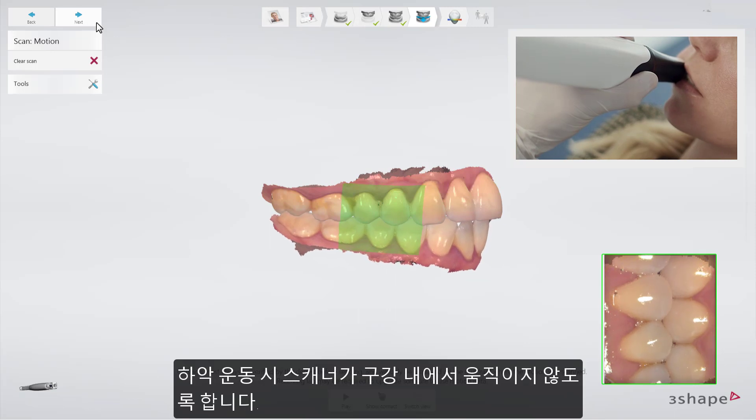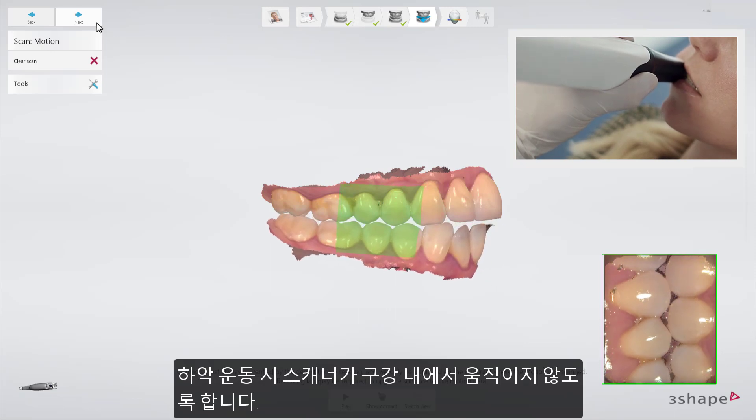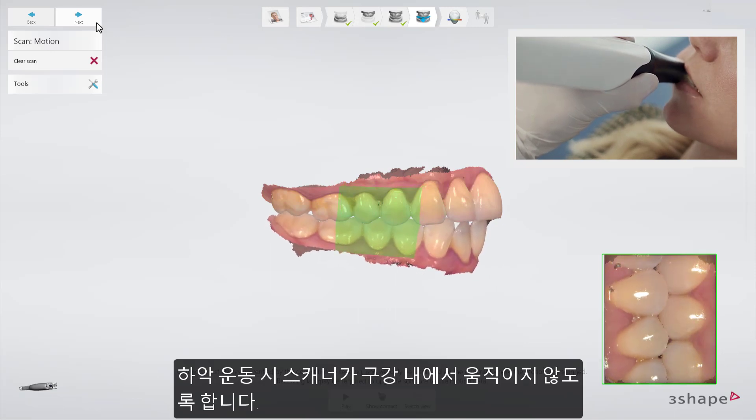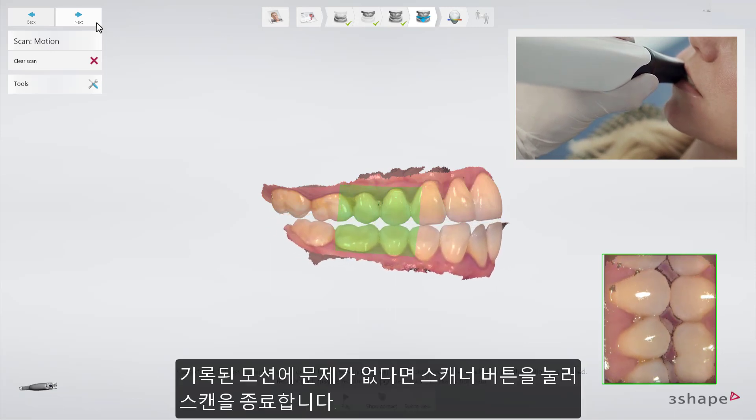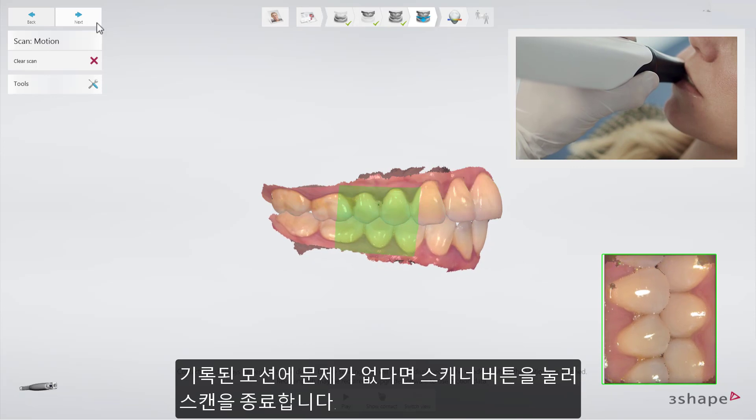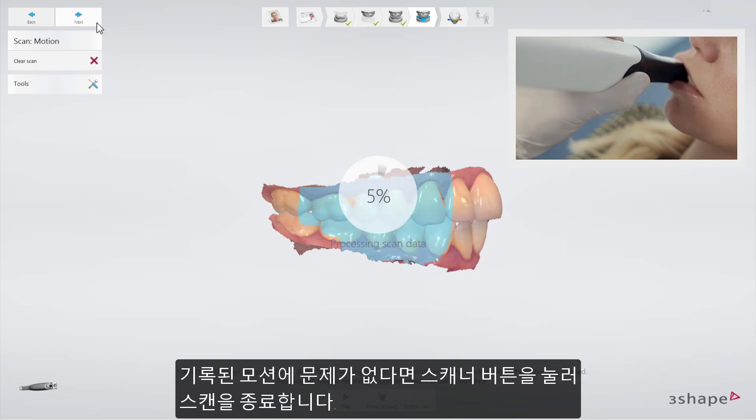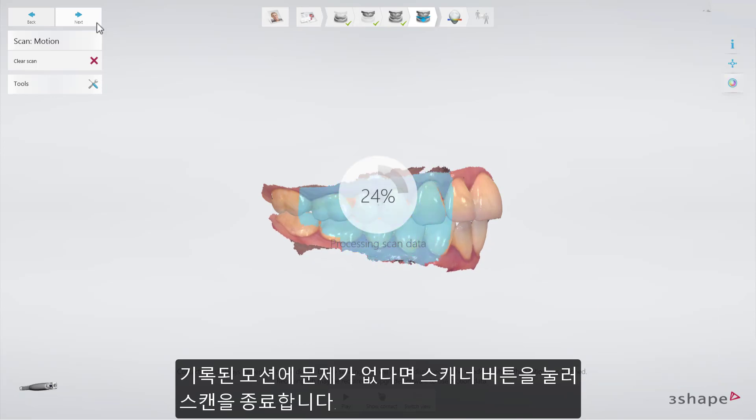Make sure to keep the scanner at the same position while the patient is grinding the teeth. When you are satisfied with the recorded motion, stop the scanning.